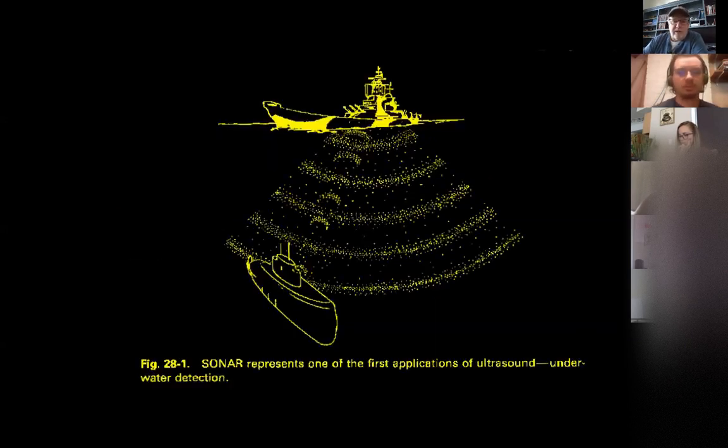So here's an example of a boat sitting on the top of the water, and this boat, you can see, sends out these volleys or pulses of sound, and that goes in all directions inside the water. In this case, the water is the medium in which sound travels. Sound has to have a medium in which it travels. As these sound waves come out and propagate through the water, they bounce off of different things that are either in the water or the bottom of the ocean or bottom of the lake or whatever. When they reflect off of those structures, a portion of that sound wave goes back to the bottom of the boat where there's a transducer. That transducer then converts that reflected pulse into a picture or a blip on the screen to tell you that there's something there.